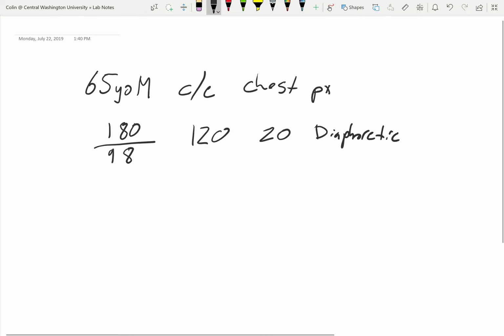So there you go. You've got a story and a set of vitals. His story is chest pain that's midline, heavy, goes to his left arm, and the vitals are saying the same thing: hypertensive, tachycardic, diaphoretic. Again, all the stuff that we've drilled into you a million times, so this should be 101 stuff.